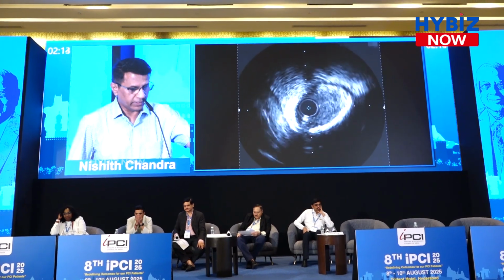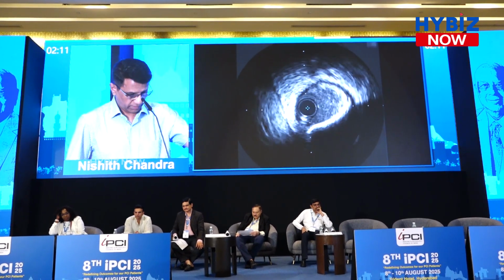Then speckle artifacts, any intraluminal signals, which Dr. Vijay has also told you about, occur when the wavelength of the ultrasound is larger than the structure, like moving RBCs. The only importance here is that you can guess the flow of blood, whether slow flow or normal flow, through the ultrasound image. If they are becoming brighter, it means the blood is flowing slowly. If it is more echolucent, the blood is flowing normally. This is just an image phenomenon which you must know.